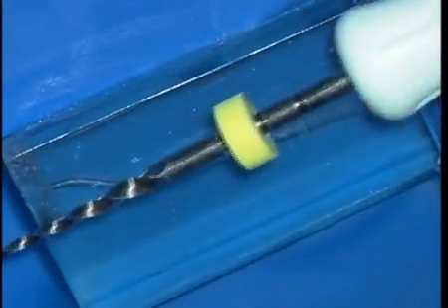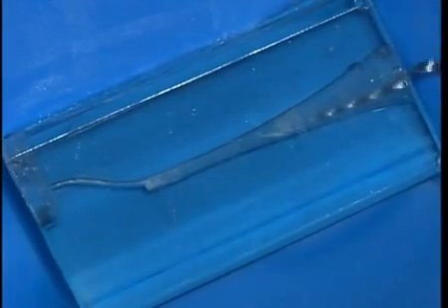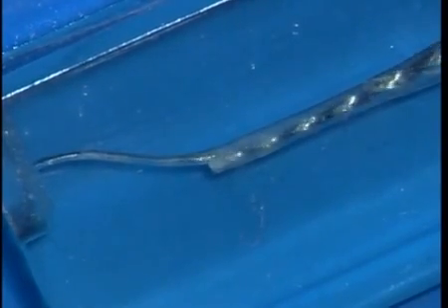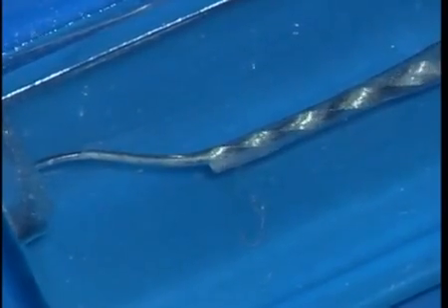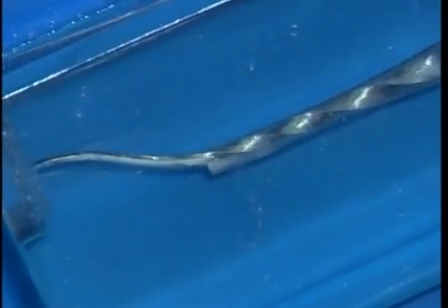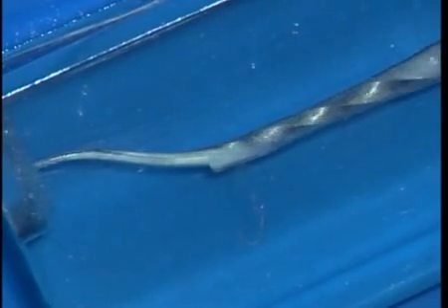The next sequential instrument would be the ProTaper Shaper number 2. Again, the pre-curved instrument is going to be reciprocated until its working end bypasses the ledge. Each one of these ProTaper instruments has multiple changing tapers over the length of their cutting blades, and these greater tapered instruments then can begin to refine and expand the glide path, and we can do some ledge reduction.